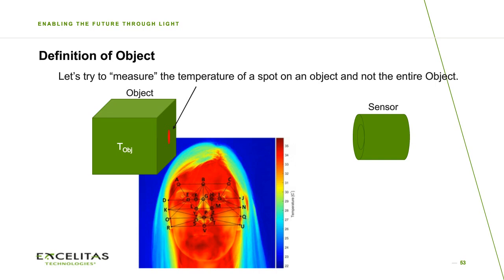But those sides might not be very good for such a remote temperature measurement, because you need to put the hair aside. If you have long hair, you will not see those sides. And when you put the hair to the side, the skin is actually still too warm, so you need some time until it cools down, so that the reading is then correct with what you have previously calculated.